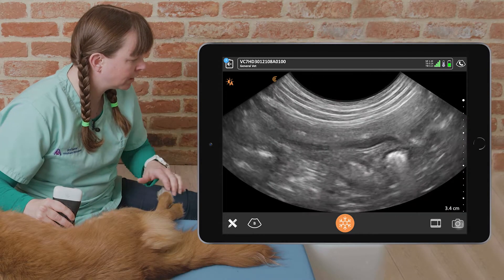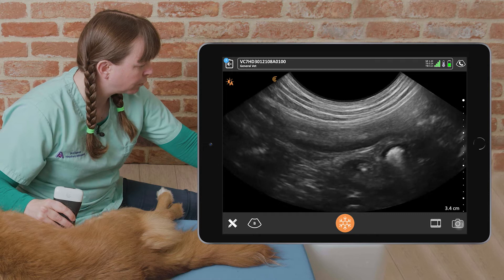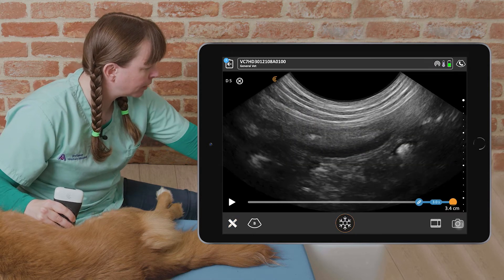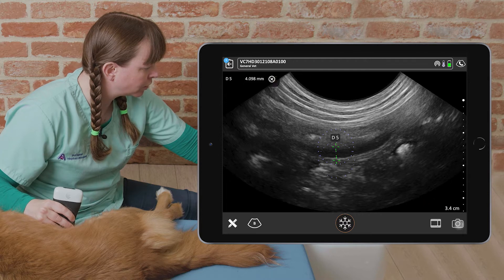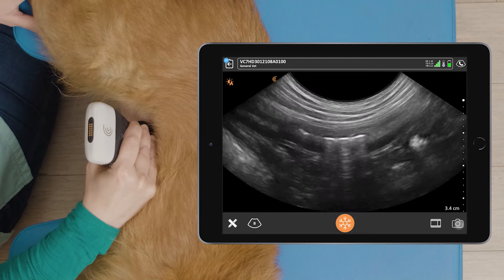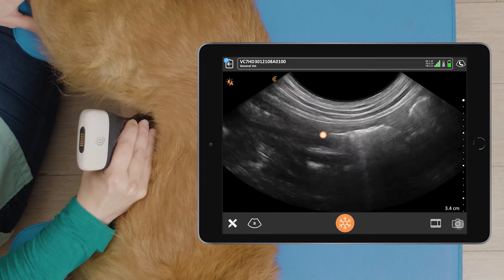We can see some peristalsis in the duodenum here. We can freeze the screen to take a measurement from the edge of the lumen to the edge of the serosa.